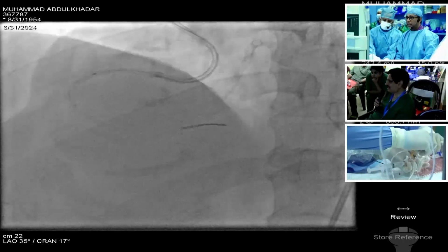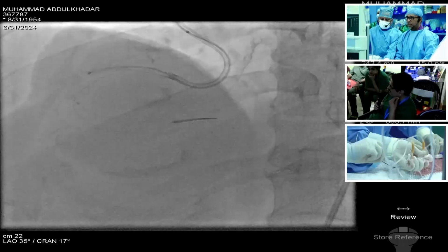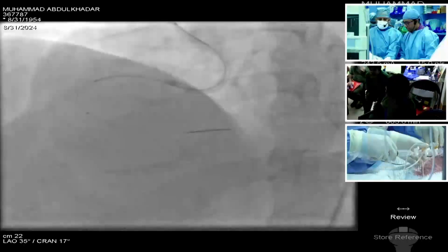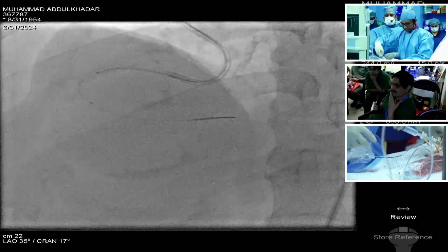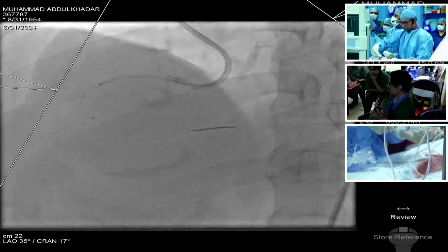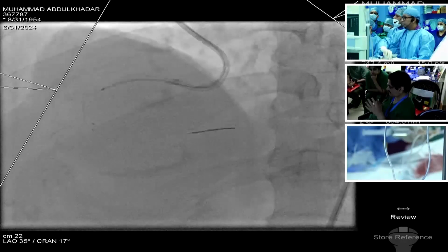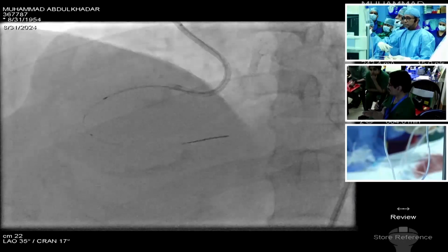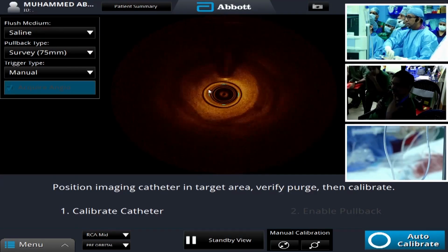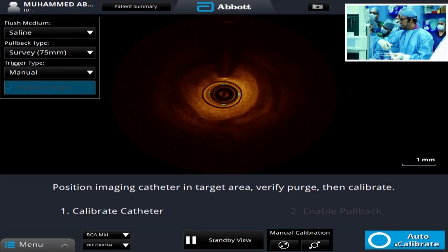So these are the very classical calcific lesions that cause problems regarding the catheters, devices, and all these. It prevents the crossability of the lesion, even though the luminal lesion was there without haziness. That rough surface will catch hold of the imaging catheter and prevent its advancement. Image on. Ready? Yes.